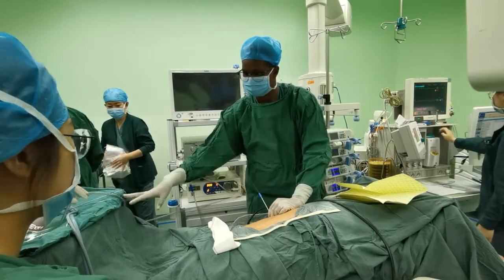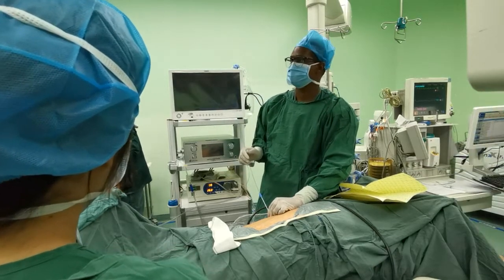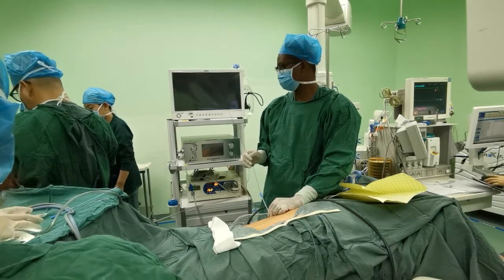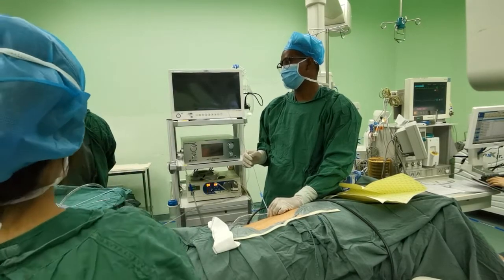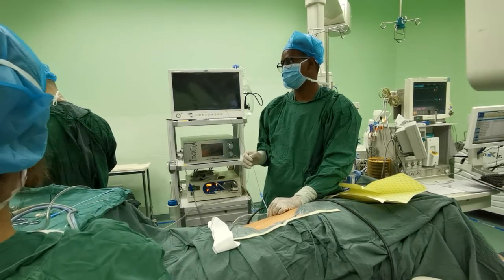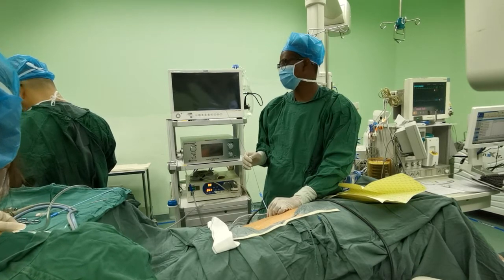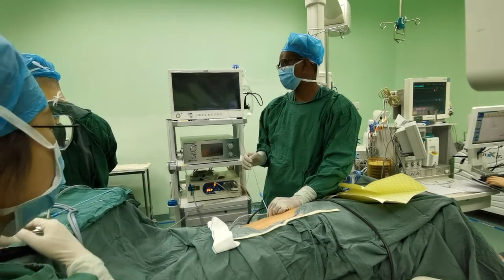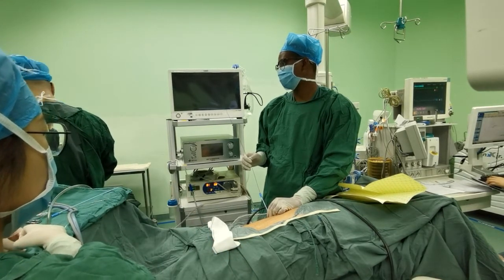He has performed more than 30,000 Chinese mini PCNL surgeries with good clinical outcomes. He invented a new minimally invasive device and technique in the treatment of mid-sized kidney stones and coined Super Mini PCNL, combining active irrigation and suction through the same sheath — a totally innovative technique and a real revolution for mini perc.